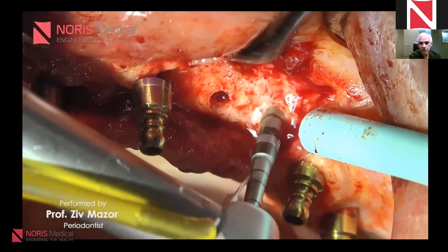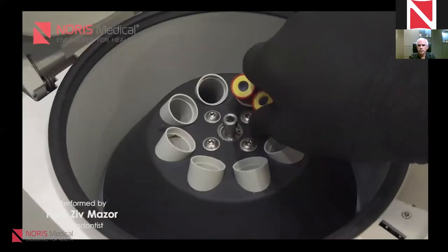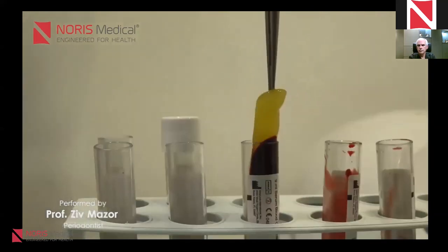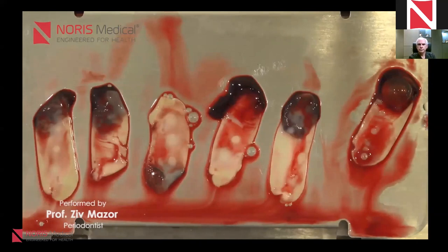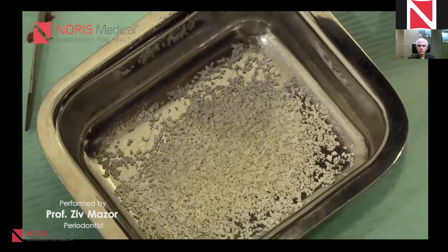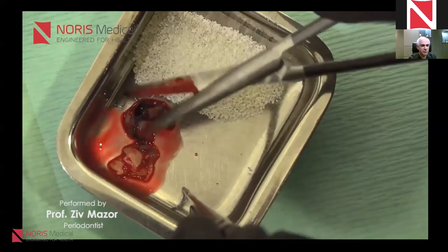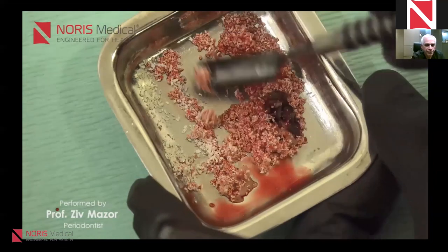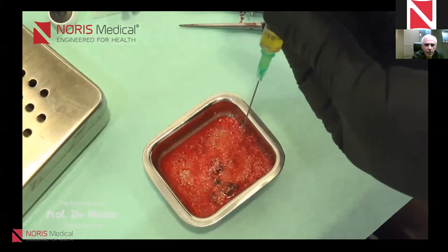And that is a nasal floor elevation reversal. Some salt and pepper, PRF, we chop it to pieces, apply the liquid of the PRF, and fabricate the PRF block.